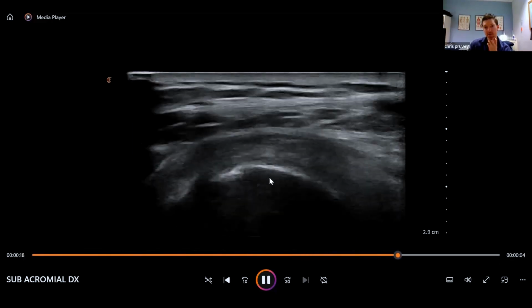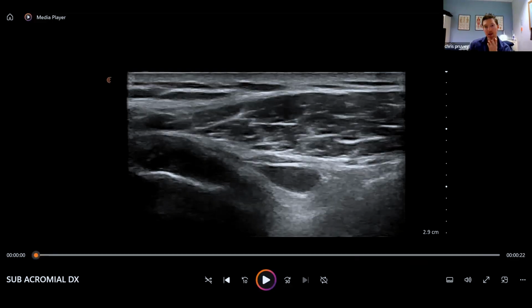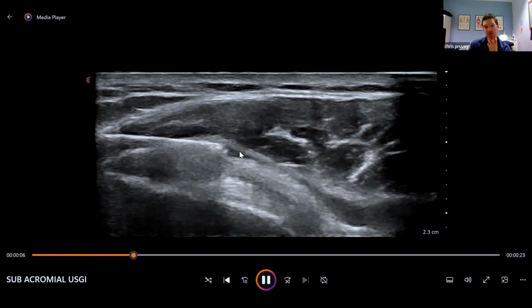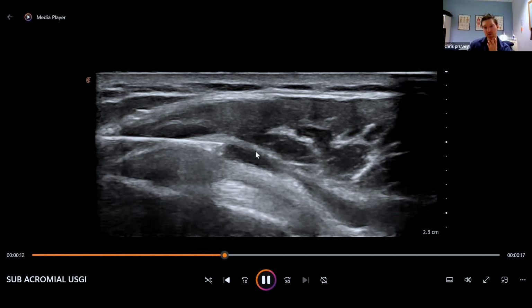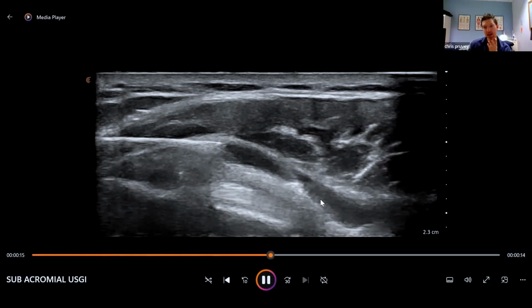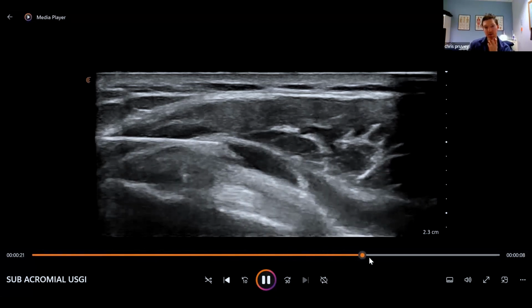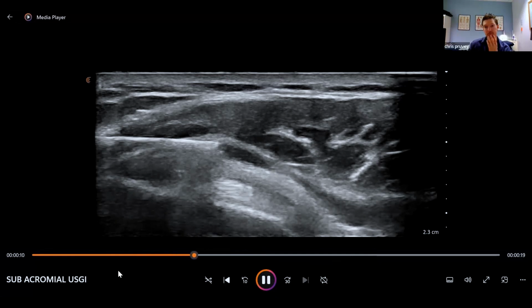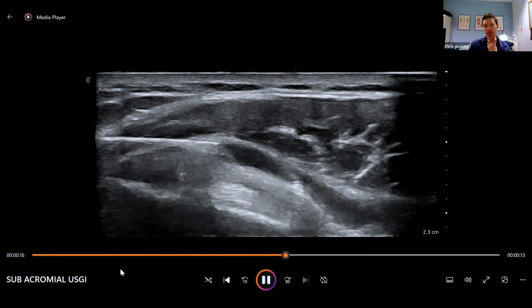So this is the tendon and the bone. And the injection, which I think you can see here, is in here. This is where the fluid was down here, but all the way, and you'll see it just distend into this area. See that? So that's when you might use a bit of volume and you get some steroid and local anesthetic in there. This is the tendon underneath it and the bone here. I'll show you that again. It just distends it. So that's another good example.